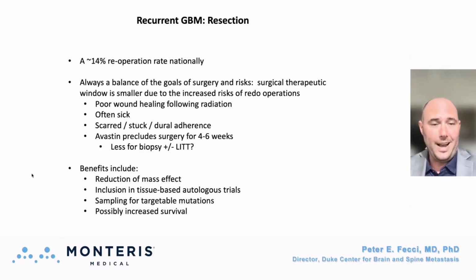They also may be on Avastin, which could preclude an open resection for a period of 4 to 6 weeks, and yet that tumor may be progressing if they're off therapy. You may need to wait much less to do a biopsy and LITT procedure. Evidence would seem to dictate that a week or 2 may be sufficient.